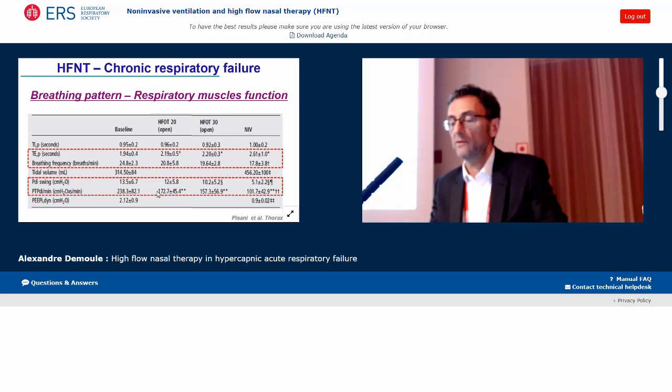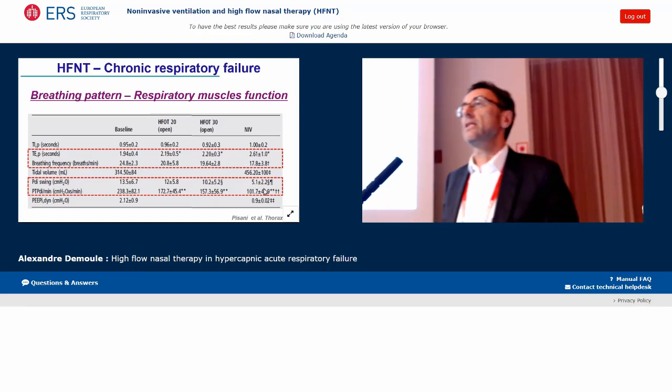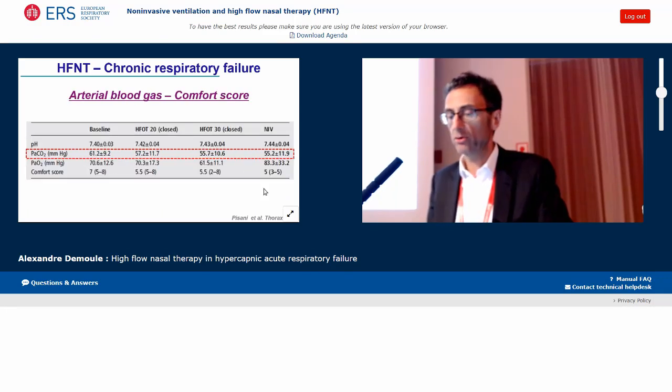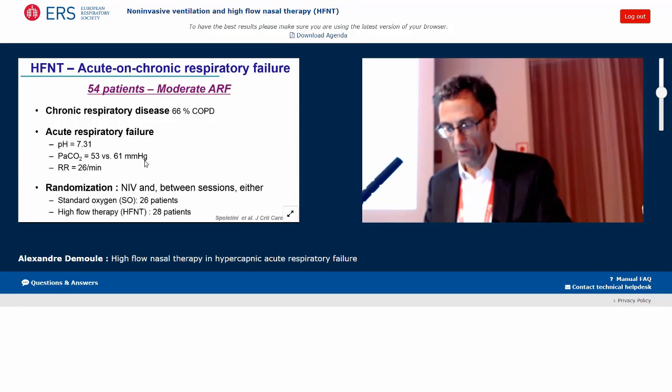You see the decrease in response to high flow therapy, less than with non-invasive, but they decrease. So there is an effect of high flow therapy on the intensity of the work of breathing, or the intensity of the respiratory muscle contractility. And this happens without major change in PaCO2, but we are talking about stable patients.